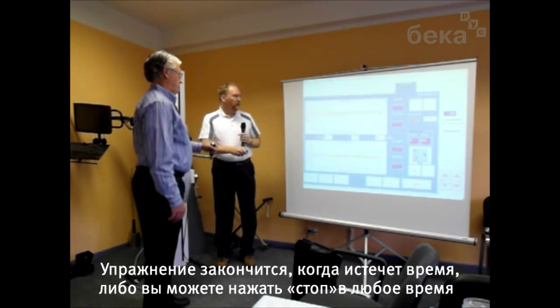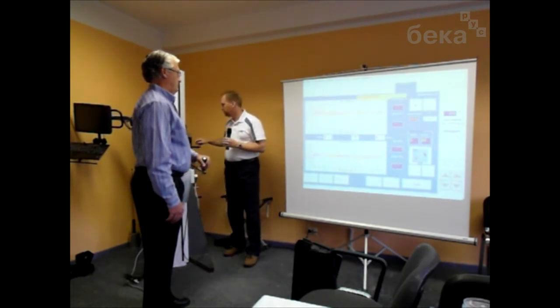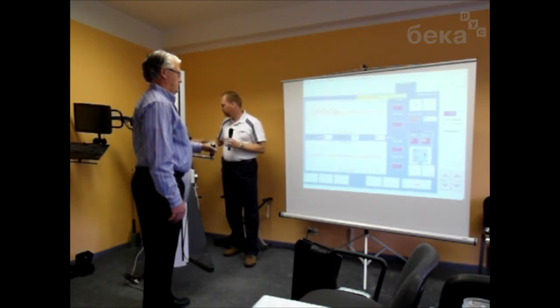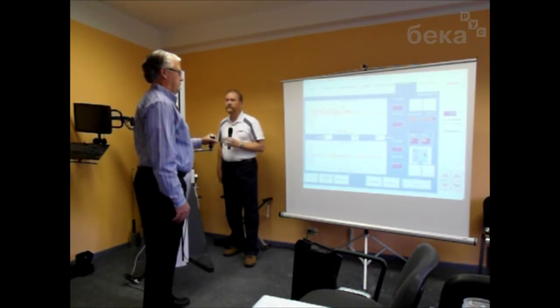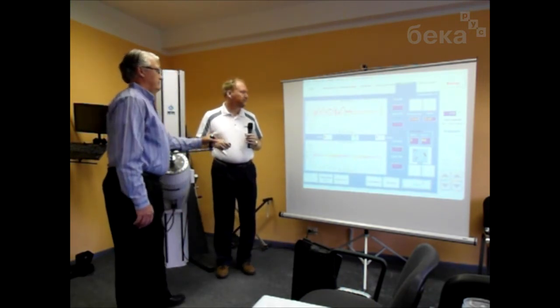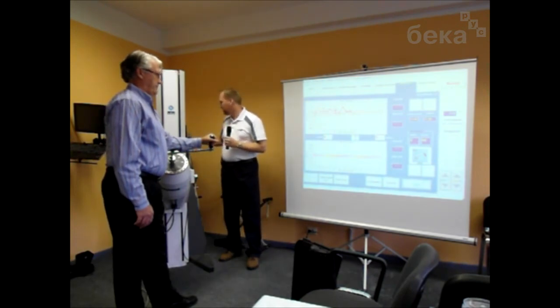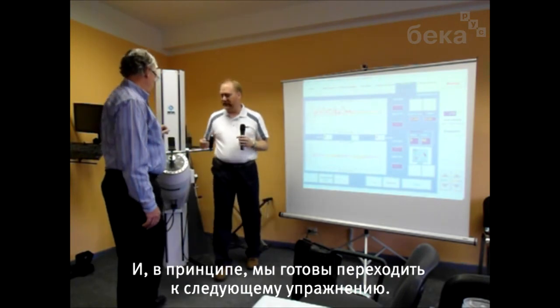So again, the timer will run out when it's completed, or you can press the stop button at any time to end the exercise. So we will save the results, and then we can move on to the next exercise.